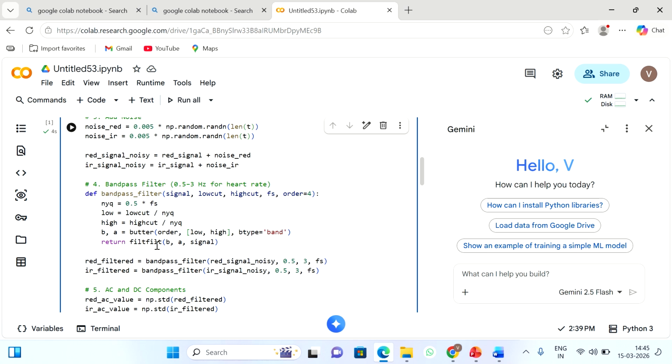So what is the meaning here? Low is equal to low cutoff frequency divided by Nyquist frequency. In the same way, high is the high cutoff frequency divided by Nyquist frequency. B is the numerator of the filter coefficient, and A is the denominator of the filter coefficient. It is equal to Butterworth filter.